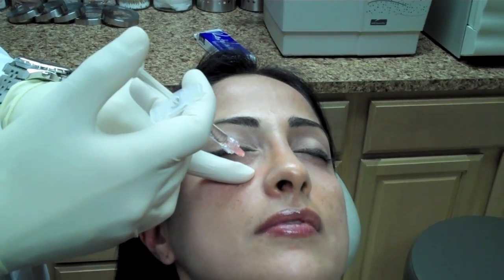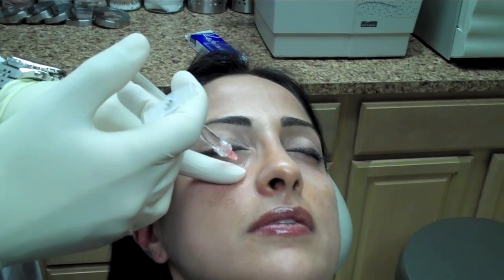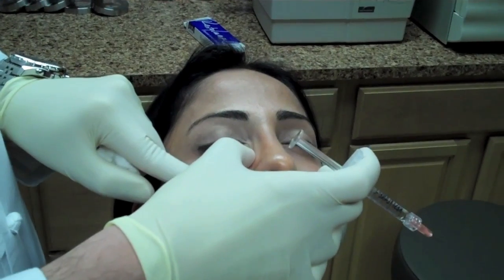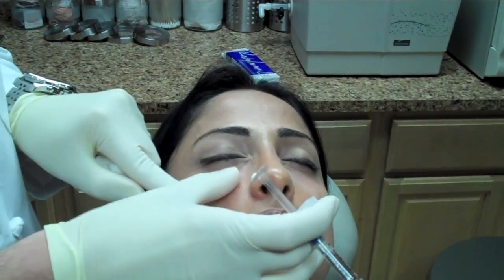Is this hurting real bad? How are you feeling? I feel no pain. Not too bad? Probably a little startling being around your eyes, but more so it's just the thought of getting the injections under the eyes, more so than the pain actually. This filler, the Restylane, actually has lidocaine in it. So as we start injecting and we start going, she's going to start feeling numbness little by little anyway. So when you go back and contour that area again for a second injection row, it'll be a lot more comfortable. And you can see right there immediately how it's lifted up.